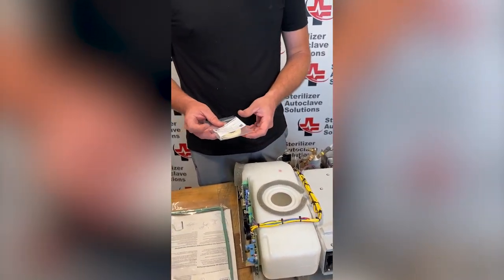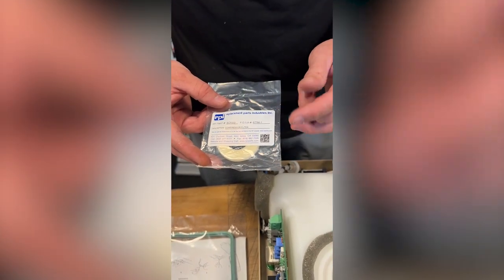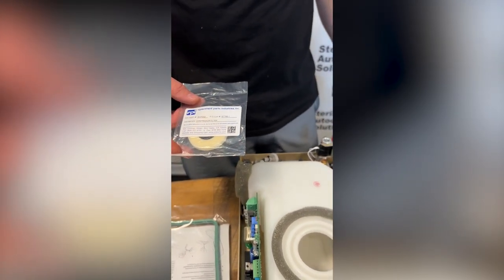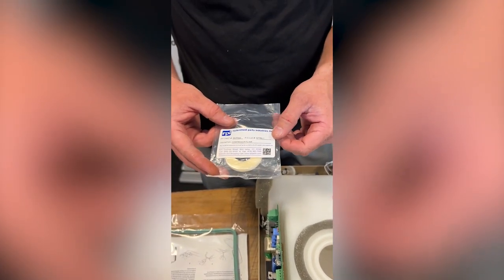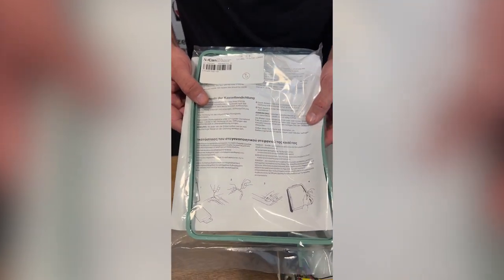Every six months or 500 cycles, you should be changing your compressor filter. You do not have to take the cover off to change this — there's a single screw on the back of your compressor that will remove the plate. You can remove that filter. And your cassette seal should be changed every six months or 500 cycles.